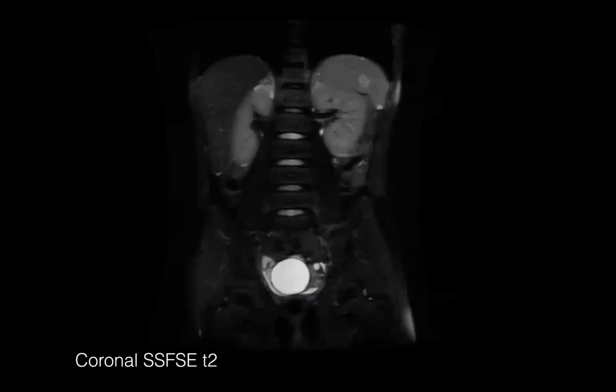Is the ovary typically this big, or is it because of the edema that it's this big? Yeah, it's because of the edema. It is not normally this big, especially in a 3-year-old. Usually what happens is right at birth it's very obvious because of maternal hormones, and then over a period of a month or two it gets much smaller, and then right around puberty again, it increases in size.